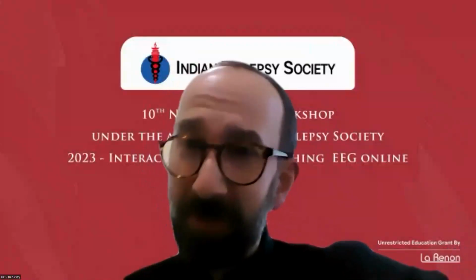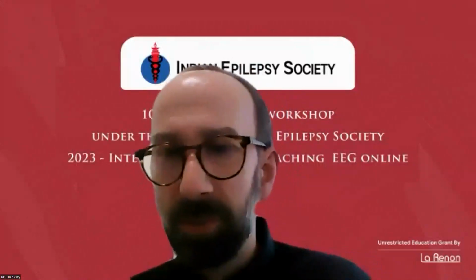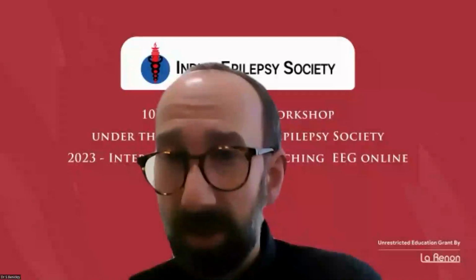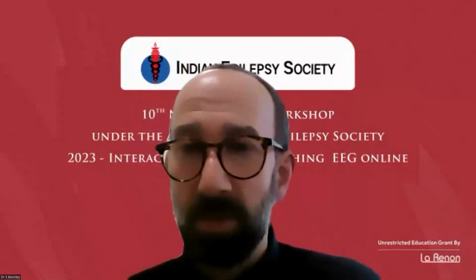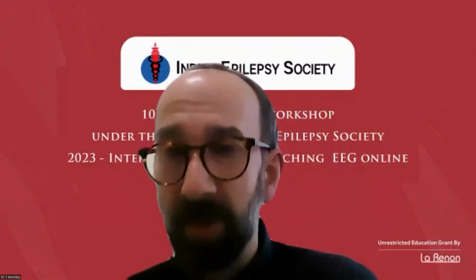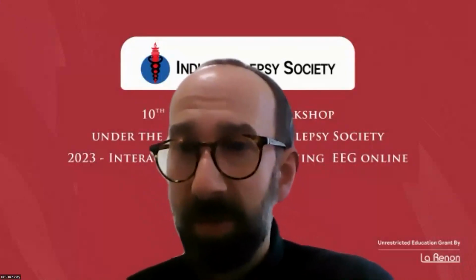Your ultimate goal is the clinical improvement, but that's something which is far away in time, and until you get that, you need to focus on outcome measures which you can see immediately or within 10 to 30 minutes, and that's the EEG. So a total cessation of the ictal pattern or the ictal-interictal continuum pattern, and also as much as possible a significant drop in the epileptiform discharges. So that's what you can see in the short run. But of course, in the long run, it's the clinical improvement that you are after.